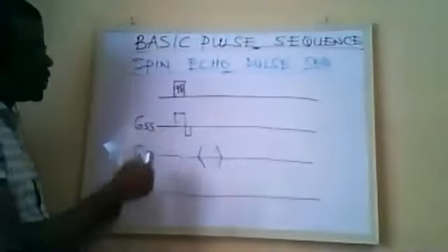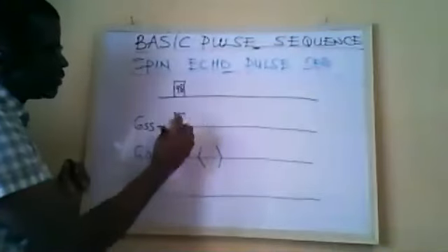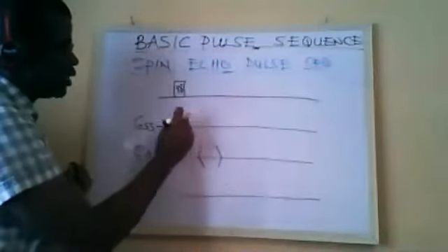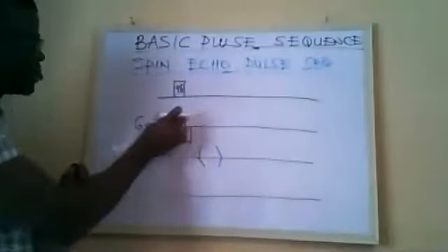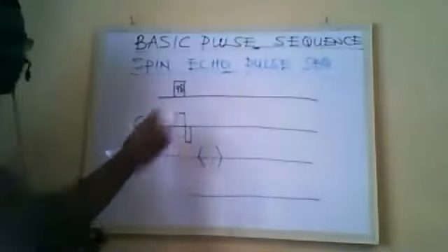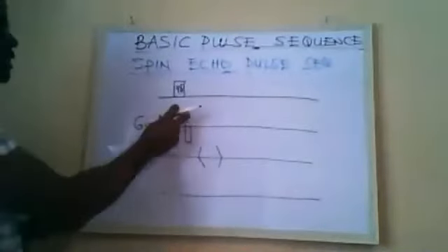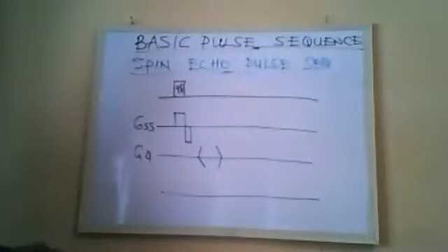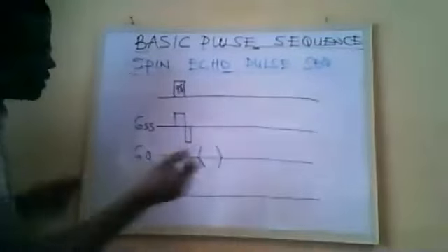So we apply it for a brief period, but slightly longer than this, so that the area of this is the same as the area of that, so that it has efficiently cancelled the effect of this. We might want to make it the same, but of course that will spend an unnecessarily long time, which we don't want to do. So that is that.